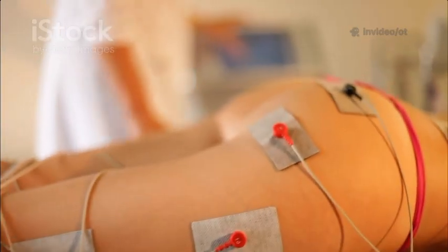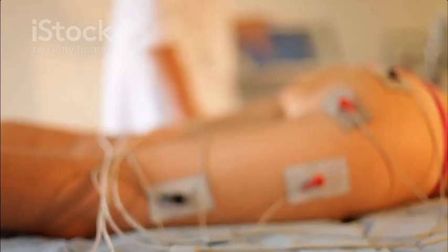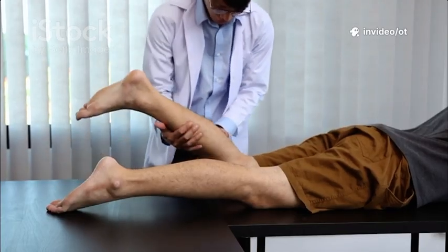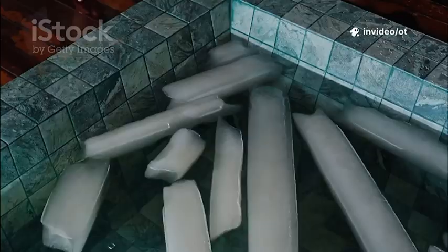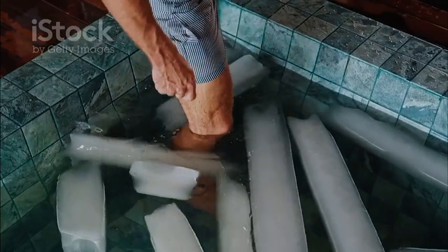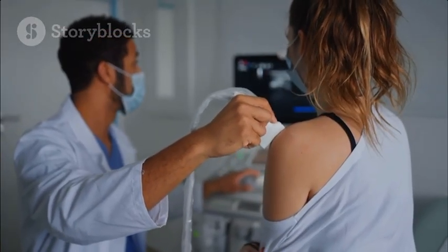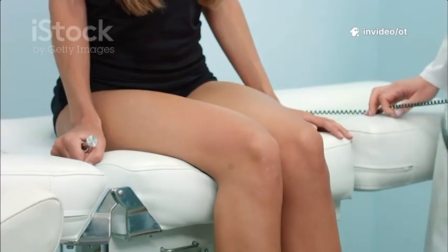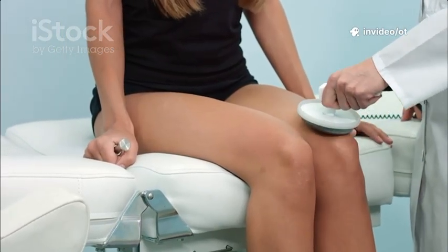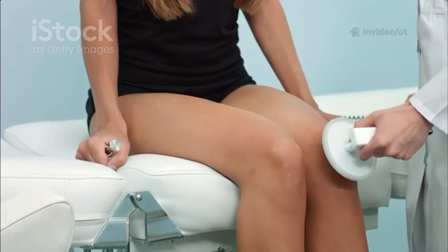Therapeutic ultrasound, a deeper approach to tissue healing. Therapeutic ultrasound uses high-frequency acoustic energy to produce thermal and non-thermal effects in deep tissues. A piezoelectric crystal in the transducer generates sound waves, and a coupling gel transmits energy efficiently by eliminating air. Continuous ultrasound generates deep heat, up to 5 centimeters, increasing blood flow, reducing spasm, and improving collagen extensibility.